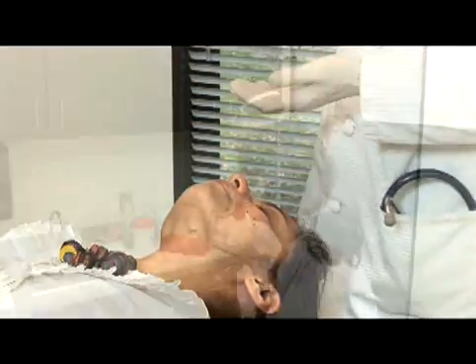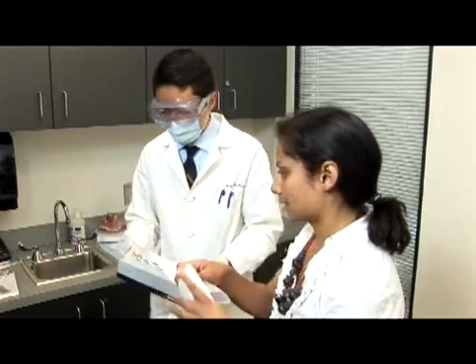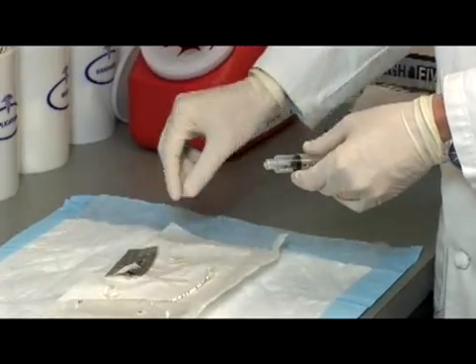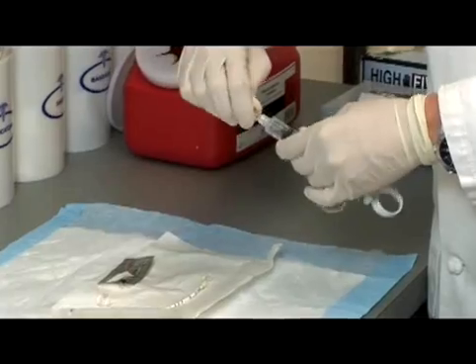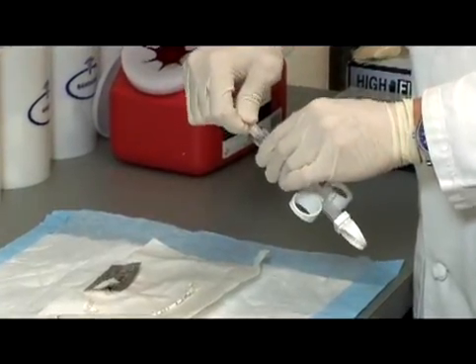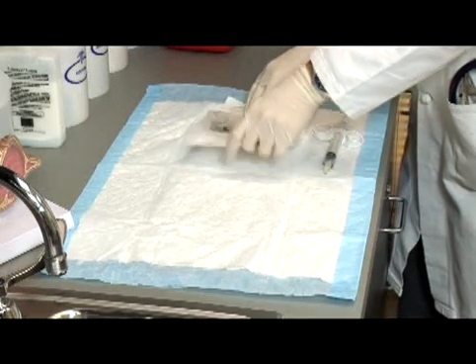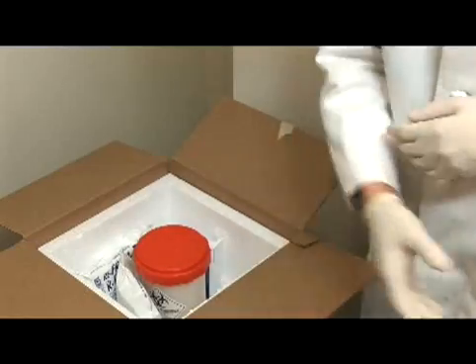Carefully remove the tube from the nose. Offer the patient a tissue if necessary. Detach the tube from the syringe. Tightly screw the syringe cap onto the syringe to contain the specimen during transport. Then dispose of the used equipment according to Biohazard Waste Disposal Guidelines. Transport the aspirate specimen to the lab in the capped syringe using cold packs to maintain the specimen at 4 to 8 degrees Celsius. Do not freeze the specimen in the syringe.